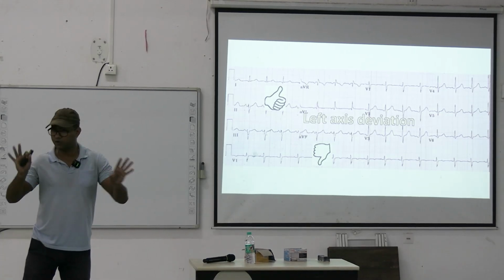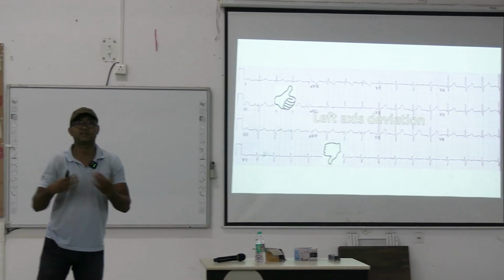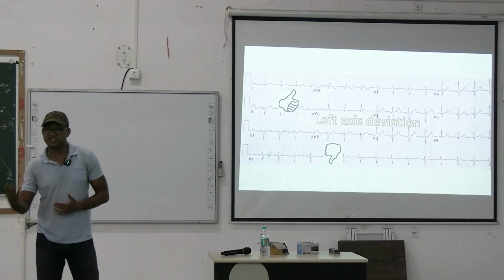Okay, we will discuss heart block later on. Right now, just try to understand how to interpret ECG axis, right?